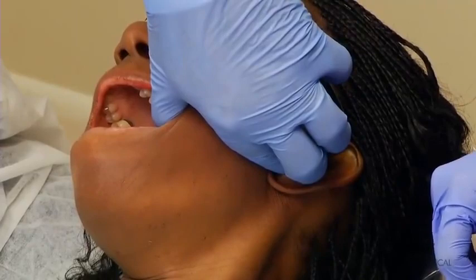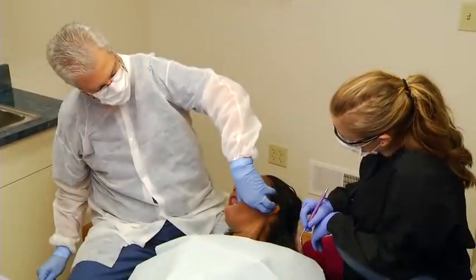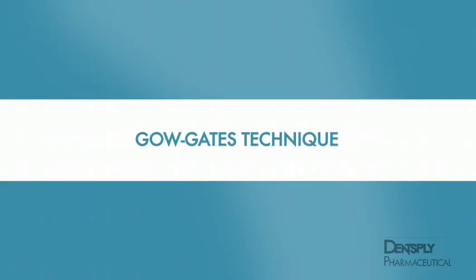The index finger may then be inserted in the intertragic notch and thus behind and lateral to the condylar neck to provide a tactile target for the needle. Gow-Gates Technique, Part 2.